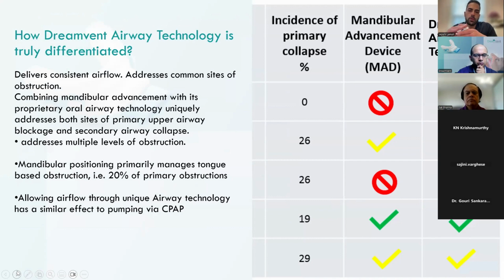One caveat for these appliances is that the patient should have at least a few teeth. We don't want a patient who's edentulous. Even if they're Kennedy class 1 or don't have any posterior teeth, it would be very difficult to fabricate this appliance for those patients. And sometimes you have to work out other things for them, for example, tongue retaining appliances for fully edentulous patients can be useful.